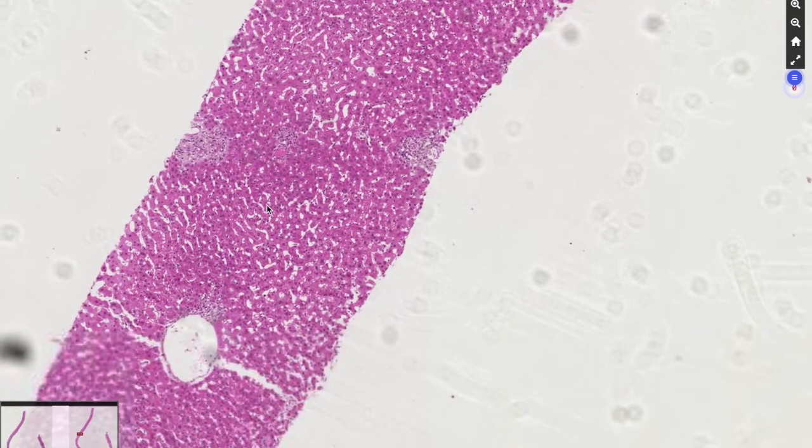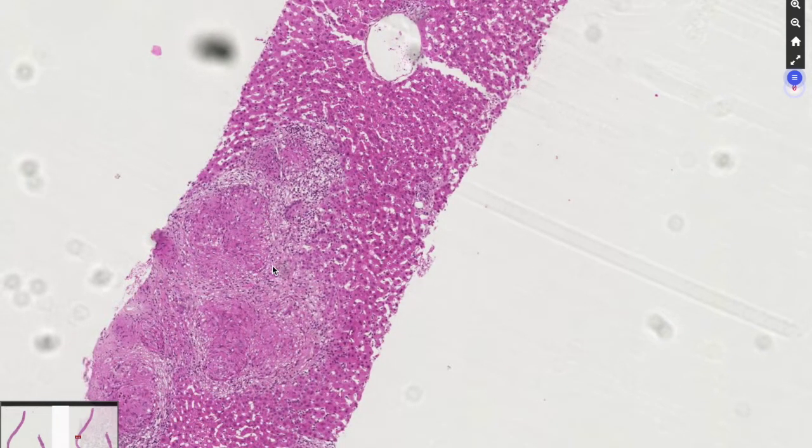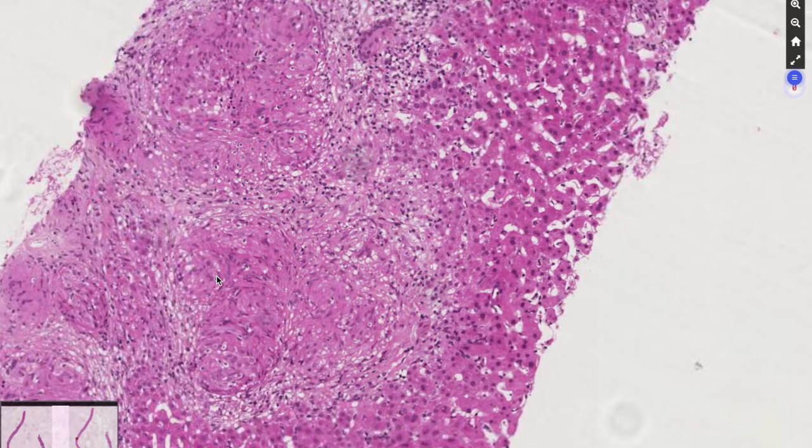So it was the main pathological finding in this case. Again, really typical ones: epithelioid granulomas, multinucleated cells. So this was a case of sarcoidosis. Of course, you cannot exclude an infection due to mycobacteria, but in this case, the diagnosis of sarcoidosis was further confirmed.